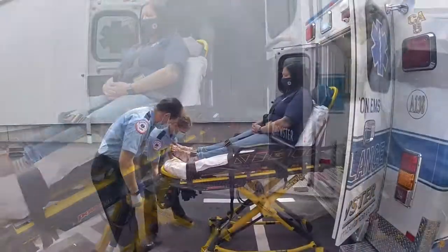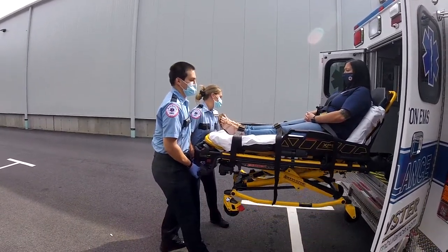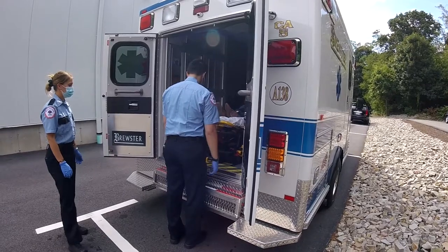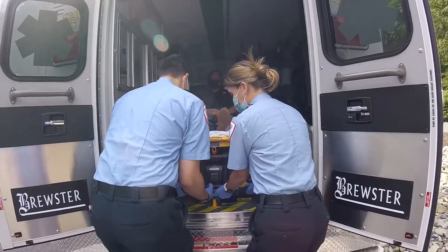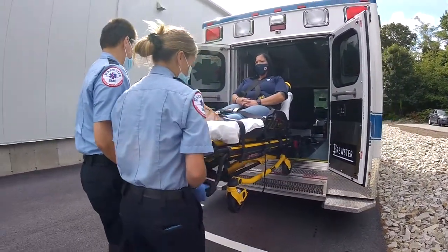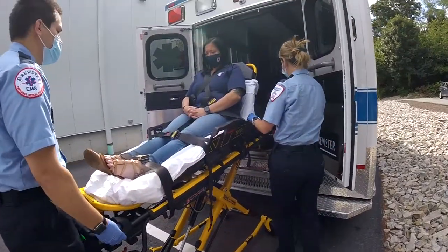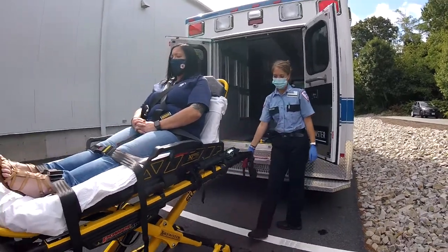Both team members are recommended to lift the power stretcher to reduce injury, since the legs of the stretcher are taken care of with the push of a button. When unloading a power stretcher, please ensure that the legs are completely down prior to releasing the button, and immediately set the stretcher to a transporting height in order to avoid a stretcher tip.